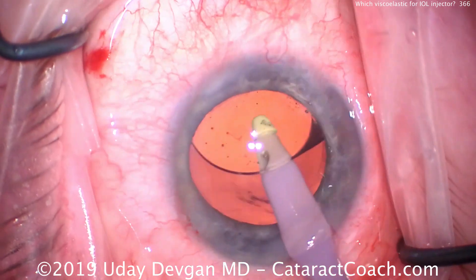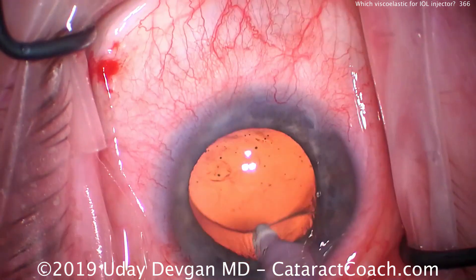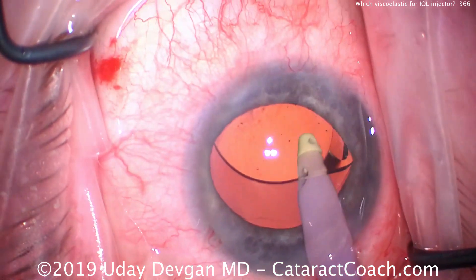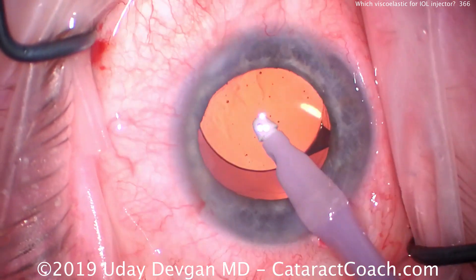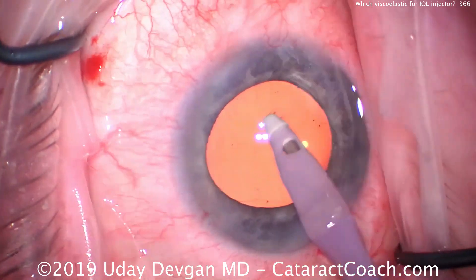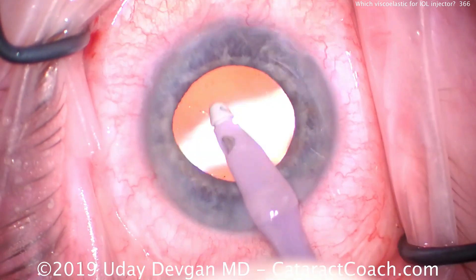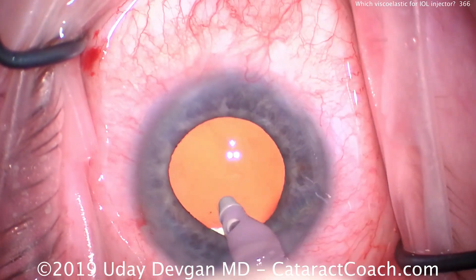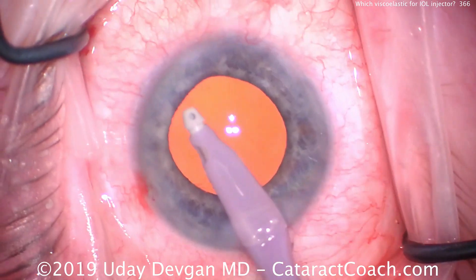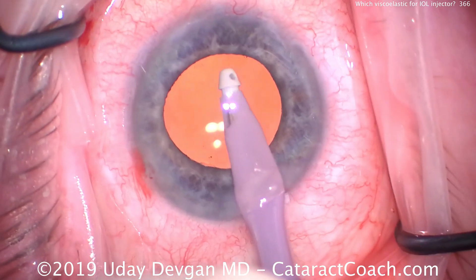I'll definitely go behind the IOL to remove the dispersive agent — I do that in every case. However, if you don't go behind the IOL, you may be better off using a cohesive viscoelastic to load the lens into the injector, as it will be removed more easily and may have less tendency for the IOL to rotate — especially important if it's a toric lens. If you are going behind the IOL like I am, you can use a dispersive agent because it lubricates the injector better, but you must be very diligent in removing all of that agent.